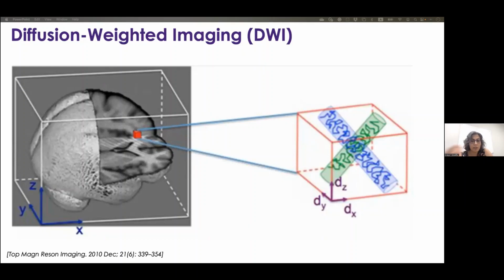Contrast-enhanced T1 and T2 weighted MRIs are commonly used to identify brain tumors. However, conventional MRI of gliomas has inherent limitations, such as inadequate assessment of peritumoral edema and integrity of adjacent white matter. Microinvasive tumor cells, which have not been detected on conventional MR imaging, contribute to poor prognosis for patients diagnosed with GBM.